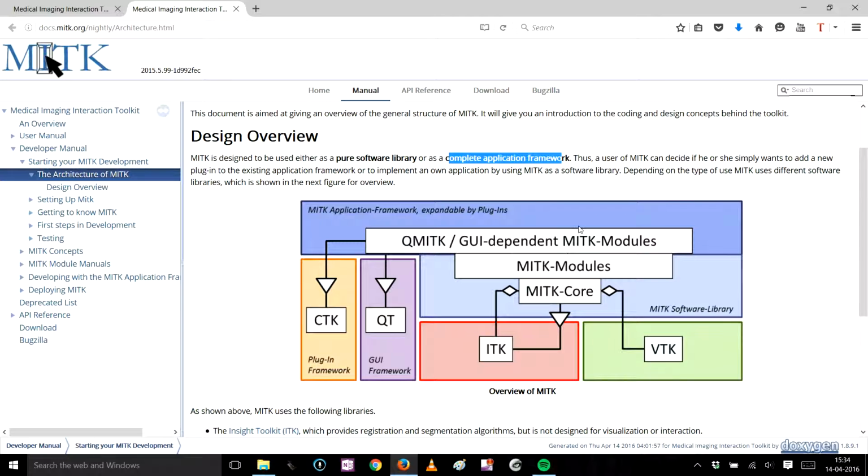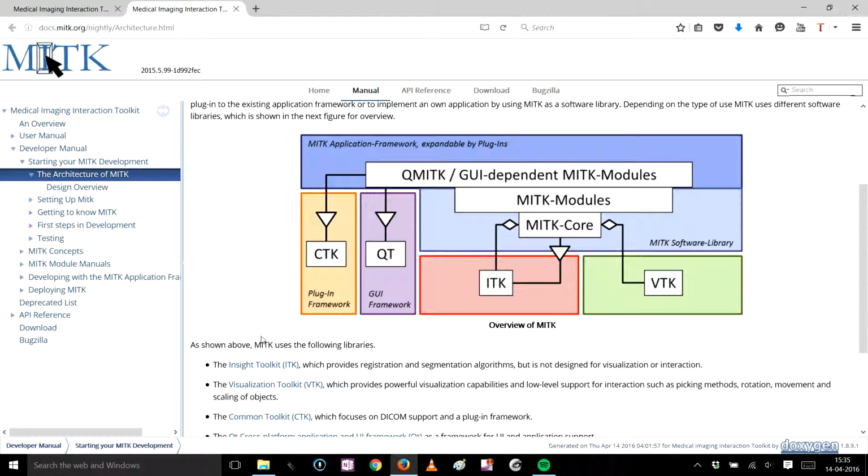For me, I'm going to use it, I think, at the application level, where we will have the application of MITK and an additional plugin for the functionality that I want to add to it. That functionality can again call functions from this library, and it can also add functions of its own and functions from other libraries and so on. So that's the idea.